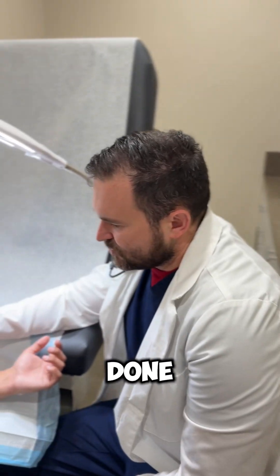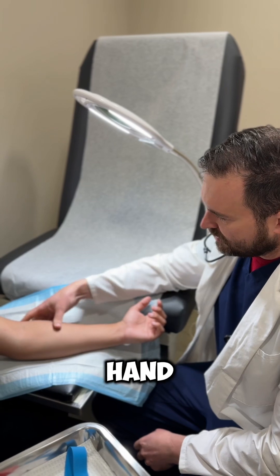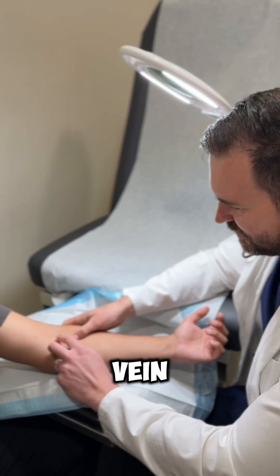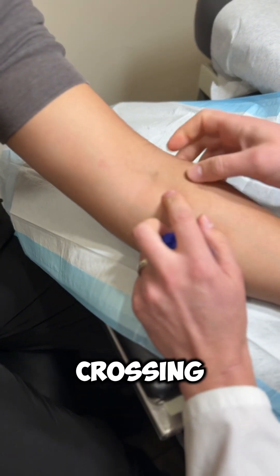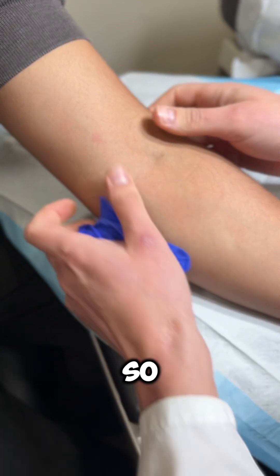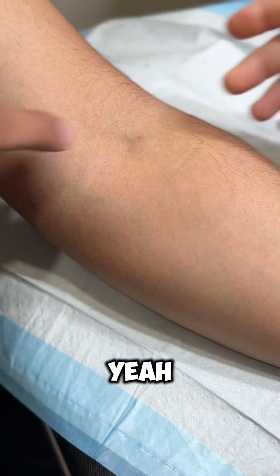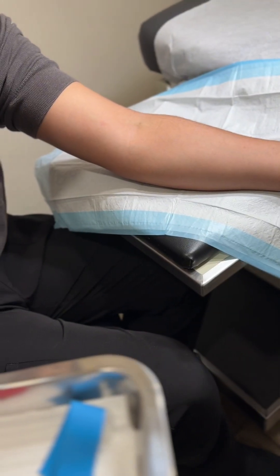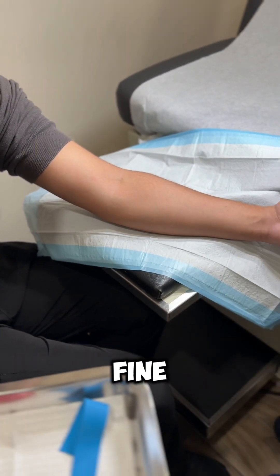When it comes to blood draws, because I've done so many in the past, I always first look at the hand — just a plain hand. I can already see Carlos has a vein here. There's a chance of maybe a crossing here, or maybe you had a blood draw recently. See that little lump right here? It's probably just from a recent blood draw — yeah, from that little dot right there.